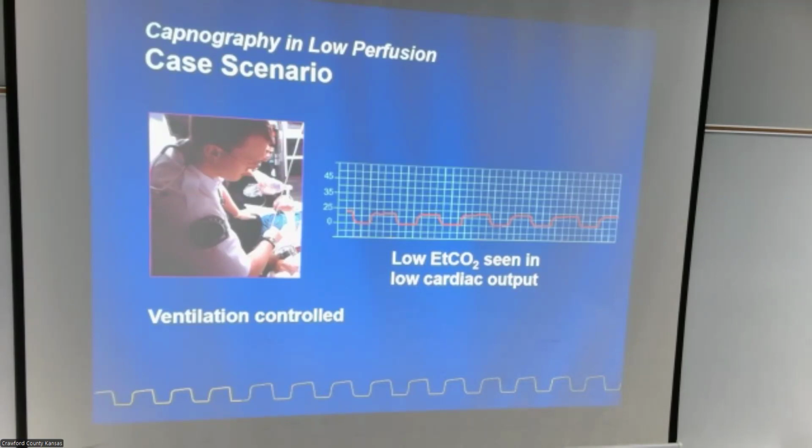He's intubated. Is he hyperventilating or are we? That's a good question. Did they intubate him on sedation alone, or did they paralyze him? Say you haven't done anything, but you slid the tube in this guy. He's still breathing on his own. What do you think needs to happen?